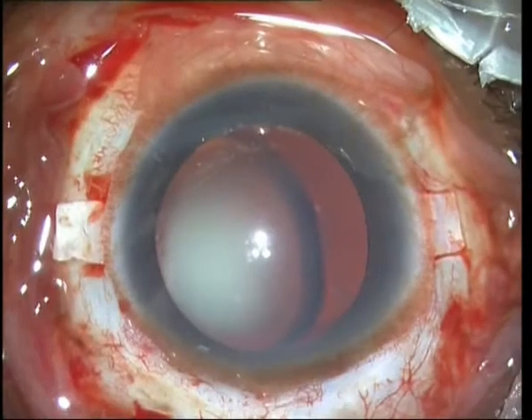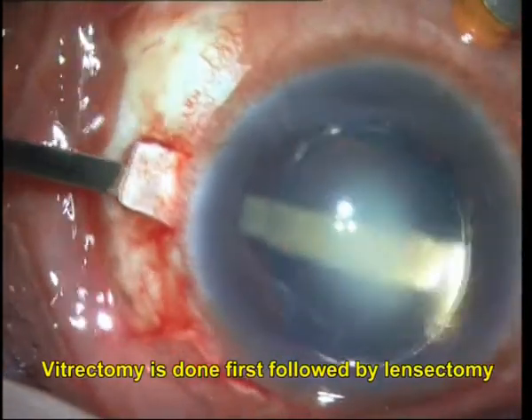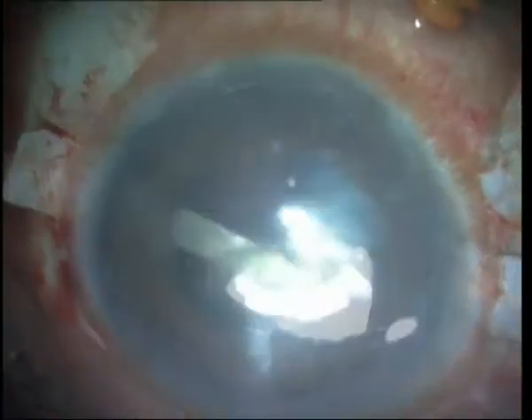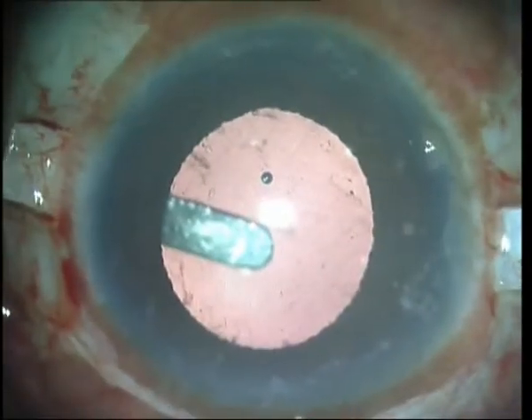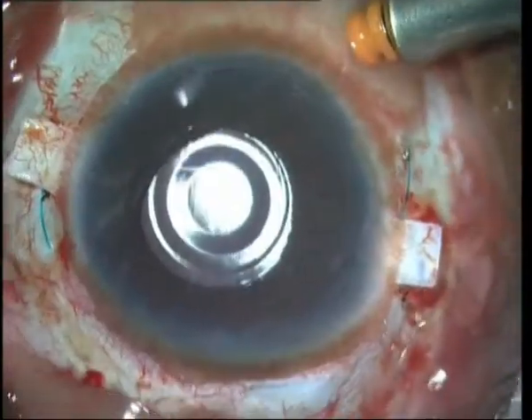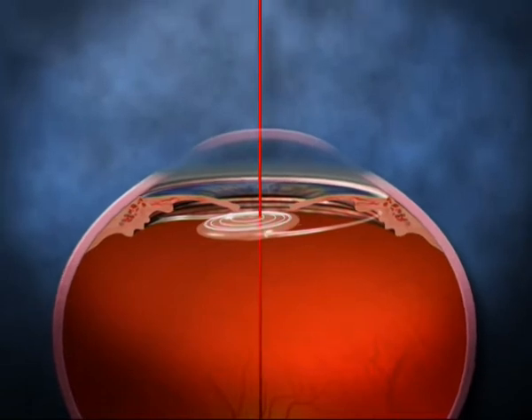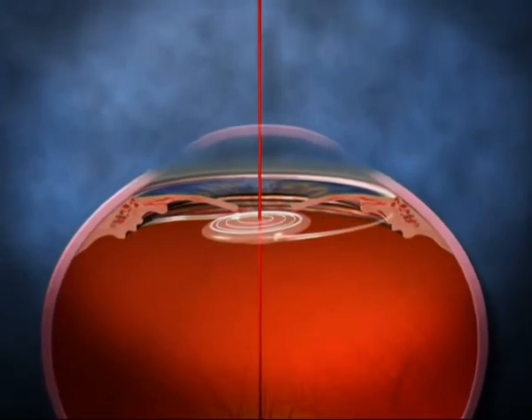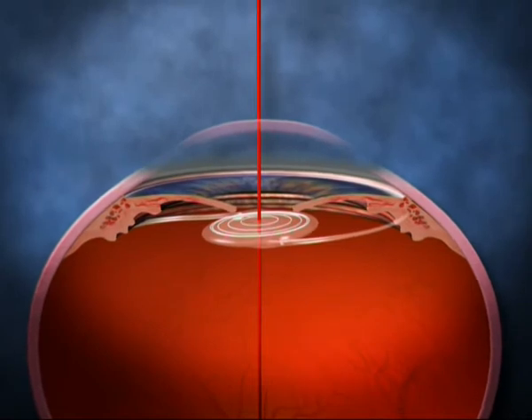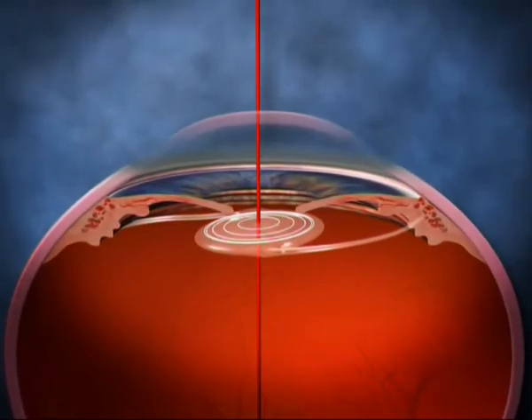In other situations, such as microspherophakia, our preferred practice is to do a lensectomy and implant a glued IOL, which, if multifocal, needs to be centered on its rings. It would also be ideal to combine this with ray optics and to be able to center the IOL ideally so that the light ray passes from fixation through the center of the rings to the fovea.